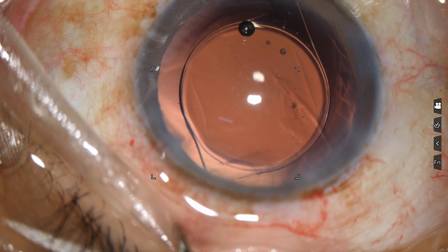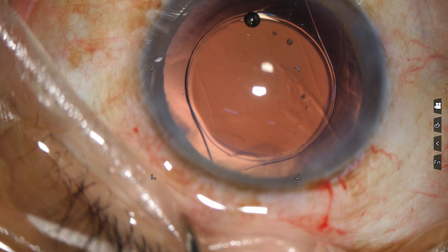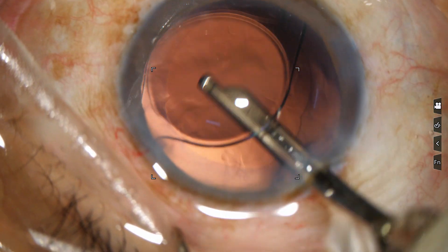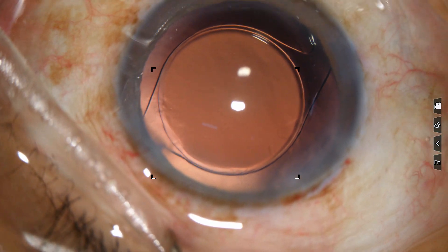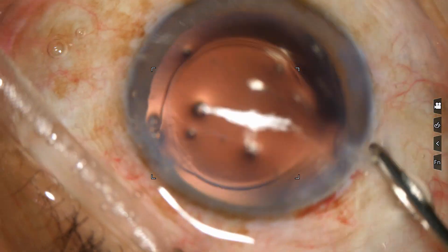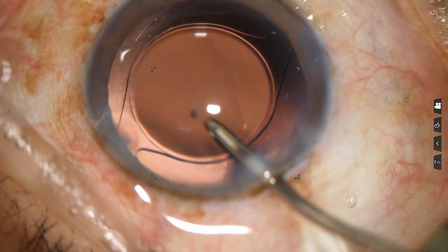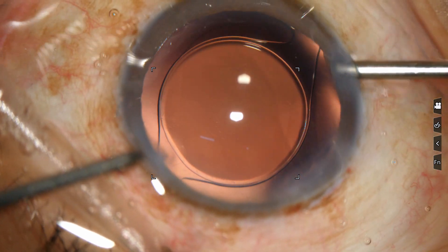Now you have to thoroughly remove the viscoelastic. What you do is: first irrigate on irrigation mode, and if I flush as well, then it becomes double irrigation. So I use double irrigation to clean the visco fast. A lot of visco has come out — go behind, use double irrigation here. By this time almost 60-70% of the visco has come out. Then use this irrigation throughout the entire chamber.